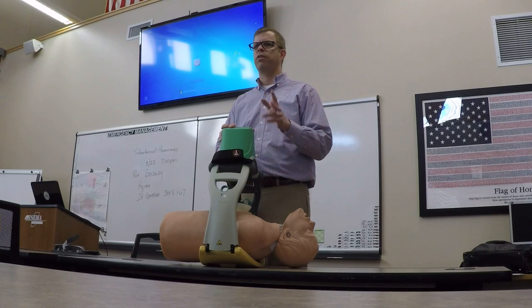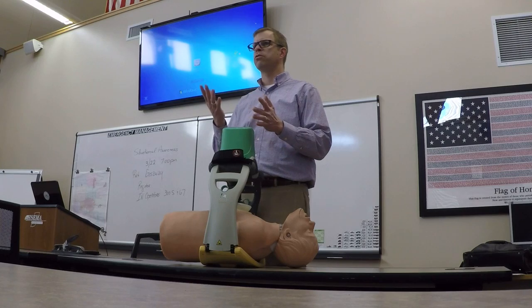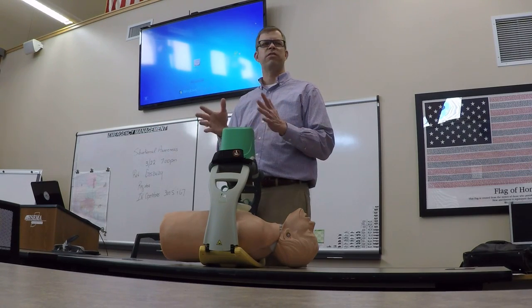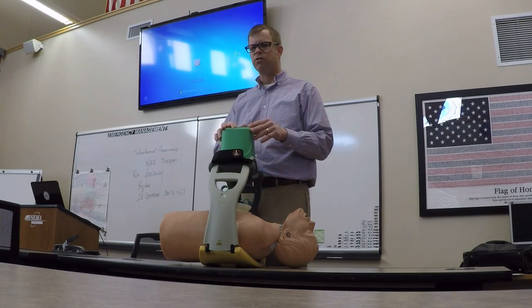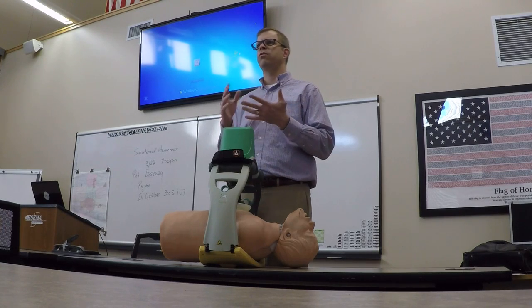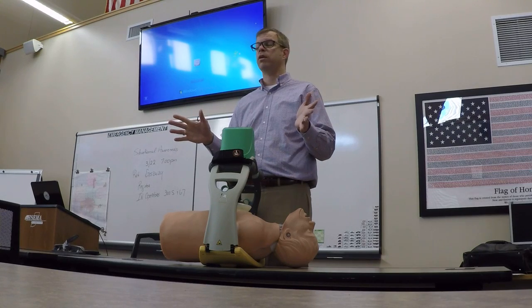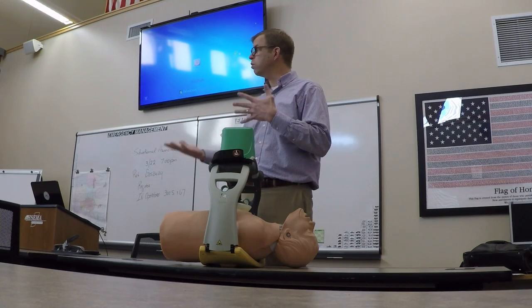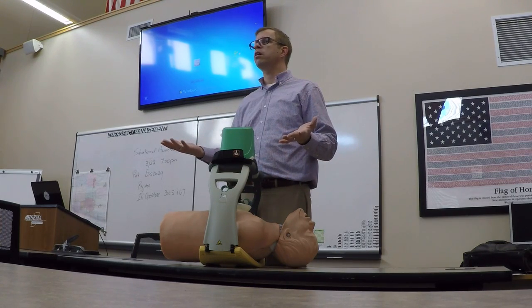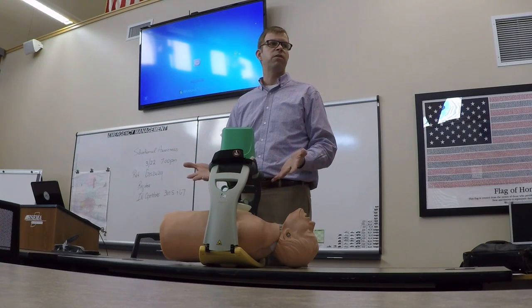The easiest thing to remember is it just does two things: two-inch depth and 102 compressions per minute, give or take two — so it could do 100 or 104. For contraindications, it's simple: if you would not do two-inch depth and 100 compressions per minute on that patient for whatever reason, you would not use this device. If you would, then you use it. For example, if you're dealing with a 12-year-old who happens to be 180 pounds, they may fit and work just fine.